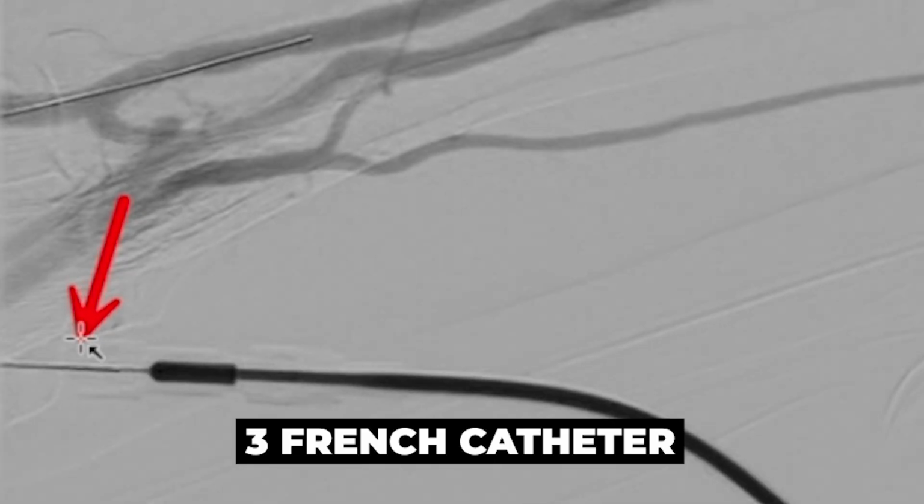What I usually do in this case is I use a 3 French catheter and I put it in the brachial artery so I can do an arteriogram and have an idea of the arteries and take a look at the veins without getting any spasm. And that is what you're seeing here.